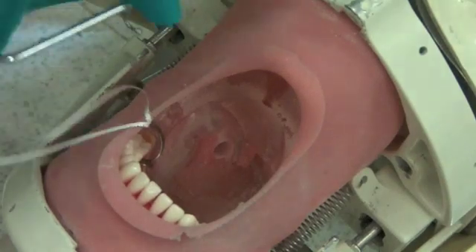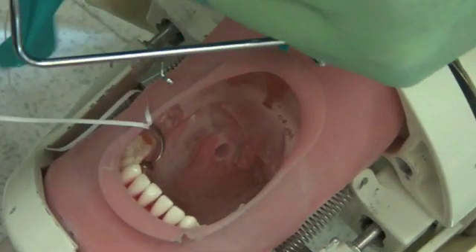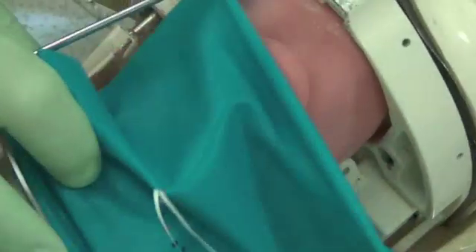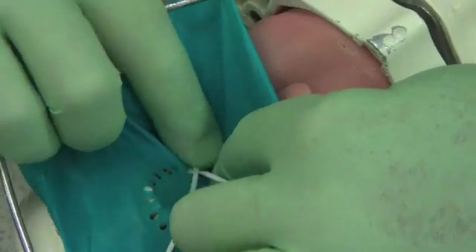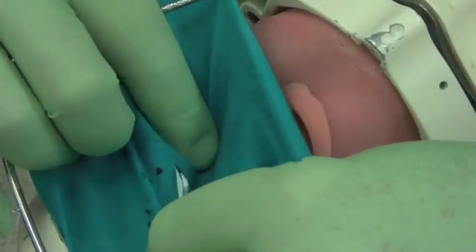Thread the floss through the double punch hole and pull taut. An assistant is invaluable for this step. Now, with your index finger, widen the posterior punched hole to slip over the rubber dam clamp and under the wings on the clamp.